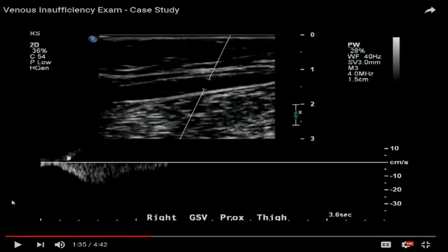Look at this over here. Is this reflux? This is above the baseline. Is this reflux? No, this is mirror image artifact emanating from the spectrum below. Sometimes this could be a complete mirror image artifact, and that is showing up only because it's a slow flow system and she is cranking up the gains. Okay, so don't fall for that.